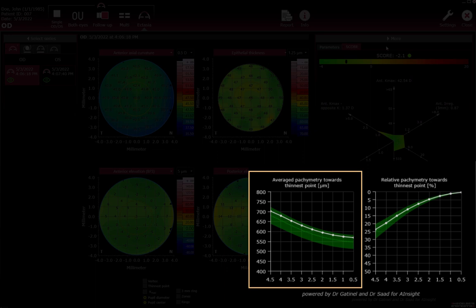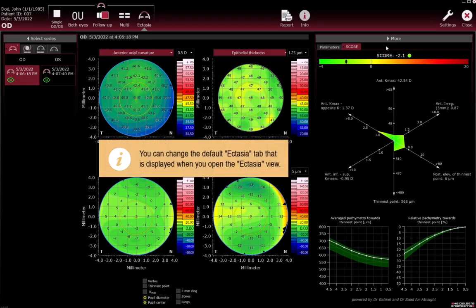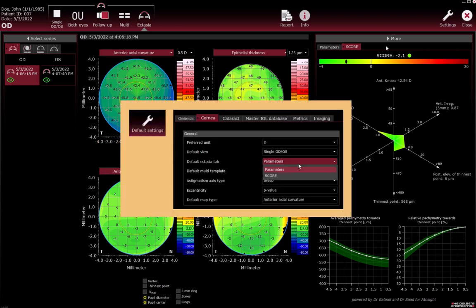The green curve represents the mean thickness plus/minus two standard deviations of a non-ectatic cornea. Each dot on the white line curve illustrates the mean concentric thickness of the patient's cornea at the corresponding measurement point on the x-axis; the white line shows interpolated values. The relative pachymetry graph shows the relative thickness difference of the patient's cornea related to the thinnest point. You can change the default ectasia tab displayed when you open the Ectasia view by choosing between Parameters and Score in the default settings.